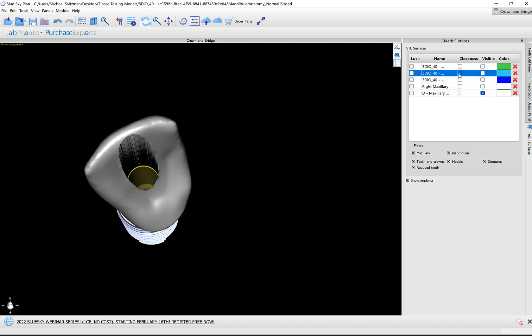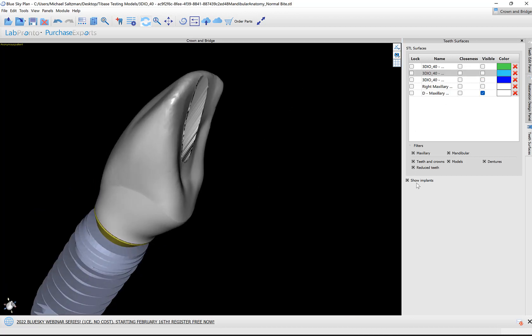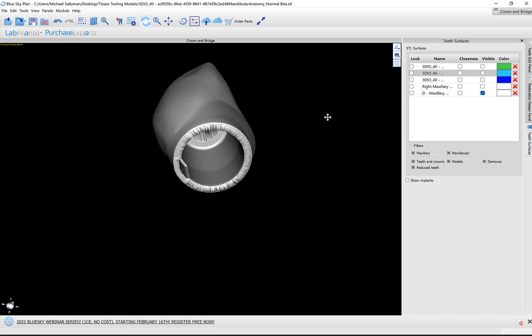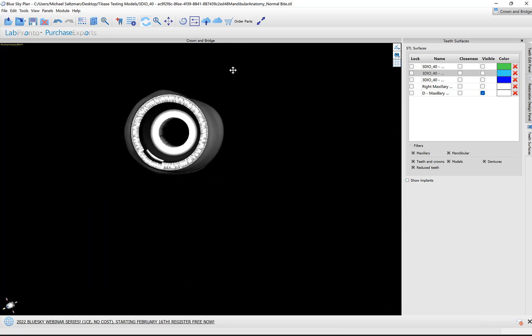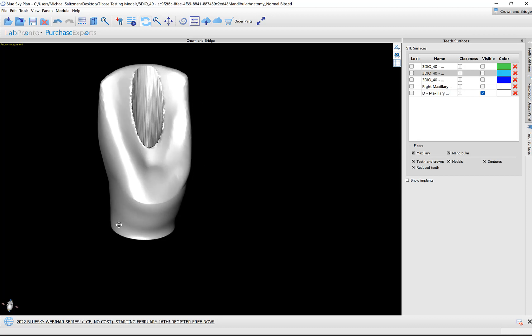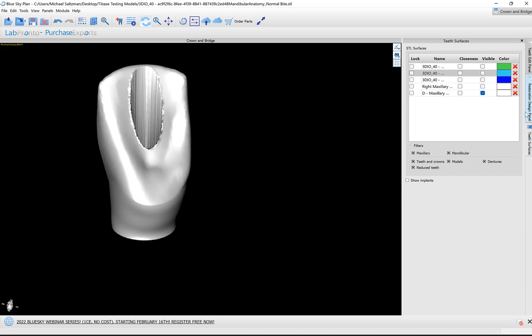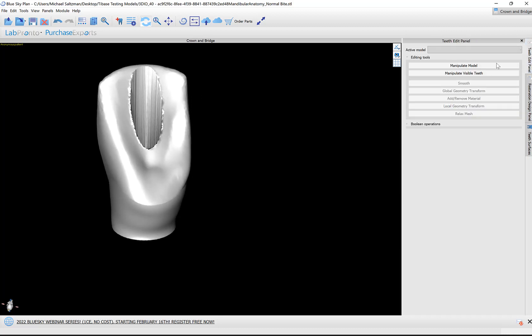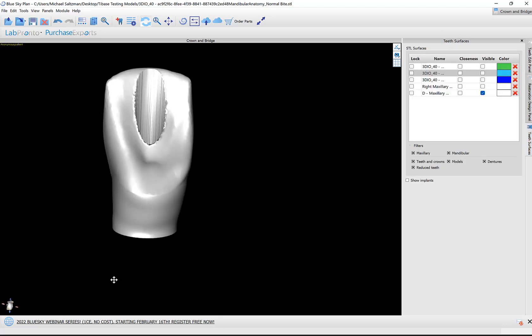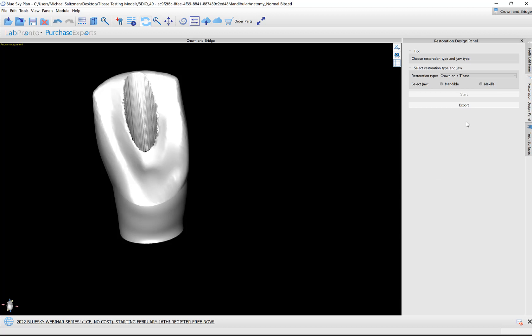Let's toggle off the models. Let's uncheck show implants for a second. So this is our designed crown. If we did want to make any further modifications, once again we have our editing tools available here. But I think we're good for now. Let's just show the export process.